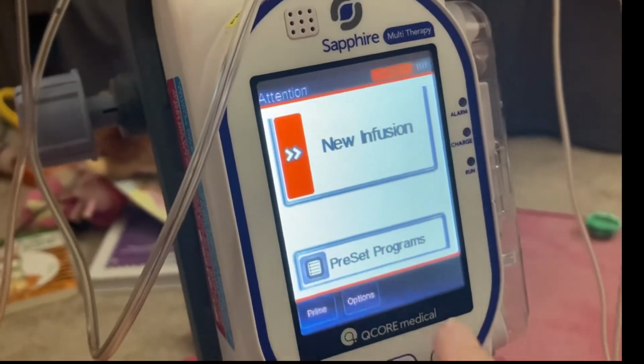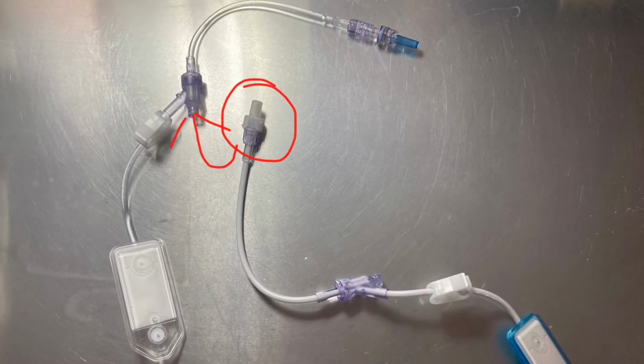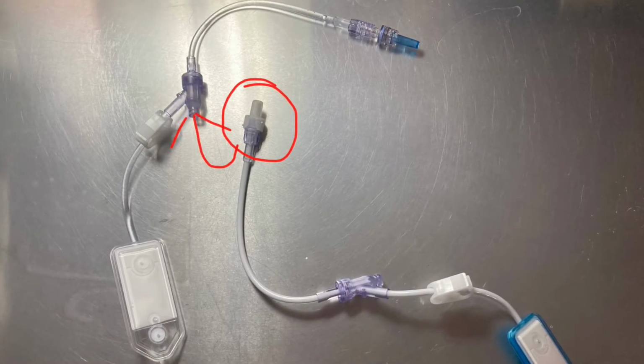I hit the bag one more time to remove any trapped air bubbles from the middle port. Loosen the cap to prime. After the TPN line is primed, now it'll be time to connect the 2 lines together.